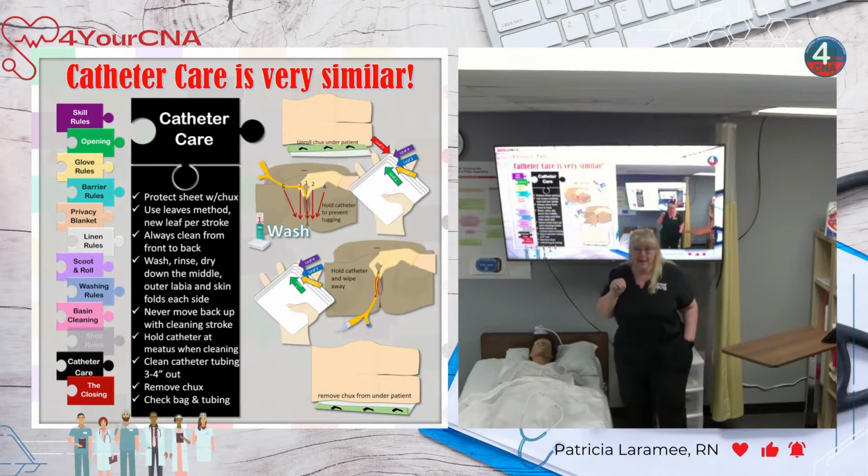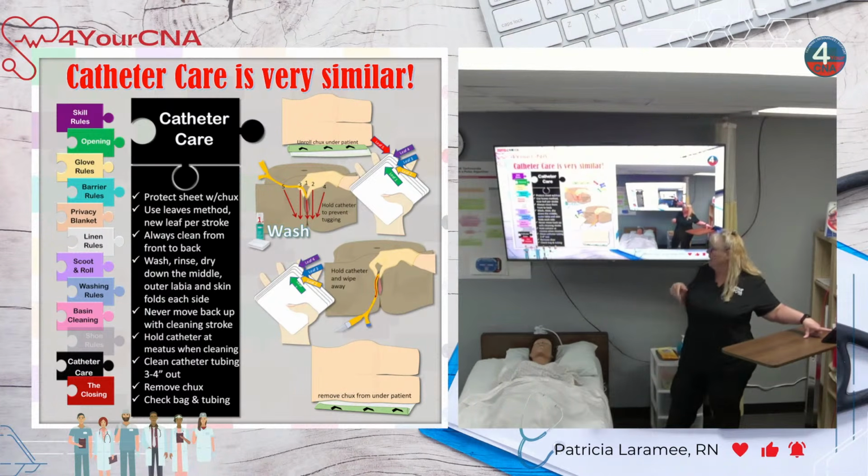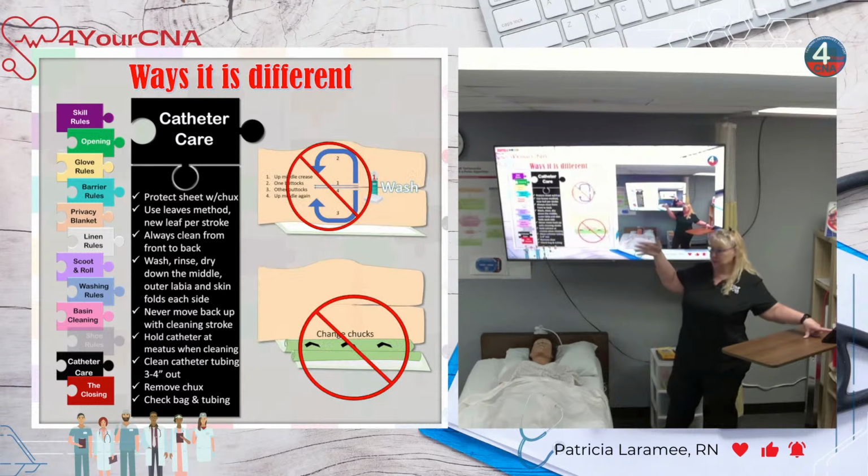So PeriCare, replace the pad. Clean the front, clean the back, replace the pad again. Catheter care, put a pad, clean the front, clean the tube, remove the pad. Got it? Very similar skills. There's not much for me to teach you with this. You know how to do this skill, right?